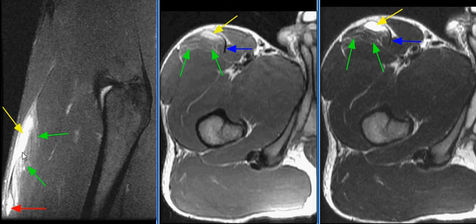The second, more distal intramuscular hematoma is located just deep to the tendon-anterior fascial interface.